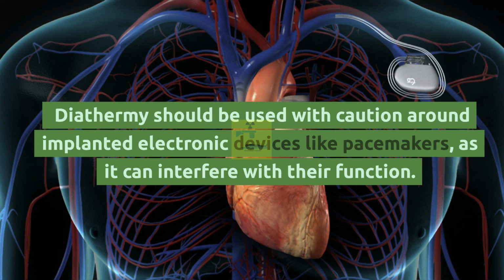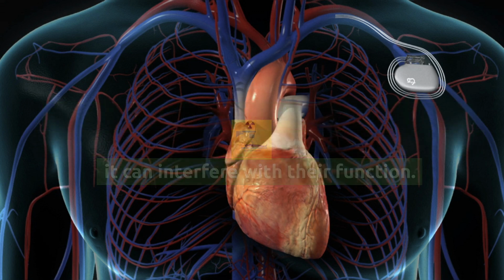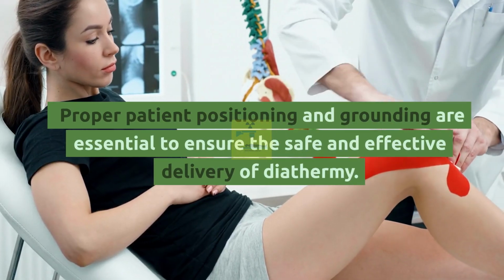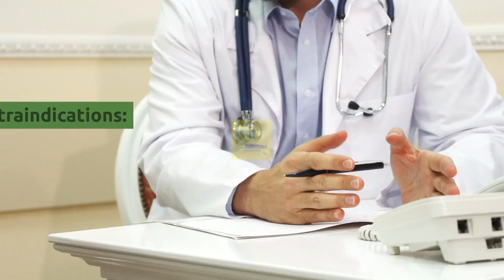Safety and precautions. Diathermy should be used with caution around implanted electronic devices like pacemakers, as it can interfere with their function. Care must be taken to avoid burns or overheating of the skin during diathermy treatments. Proper patient positioning and grounding are essential to ensure the safe and effective delivery of diathermy.